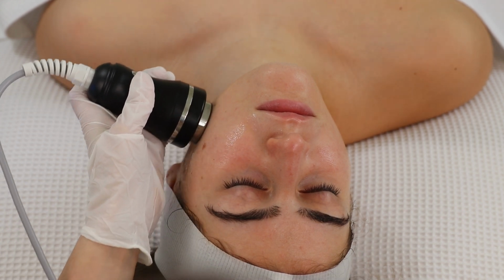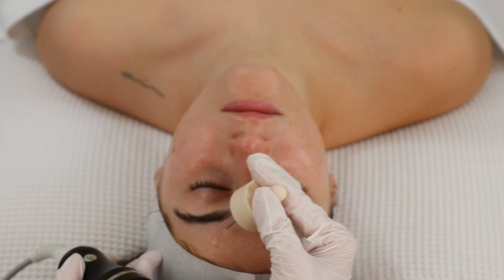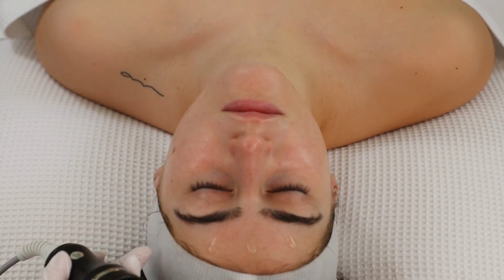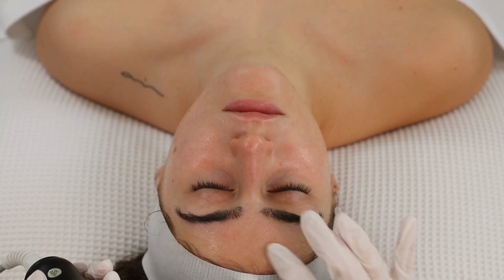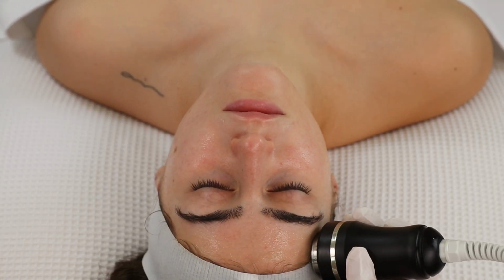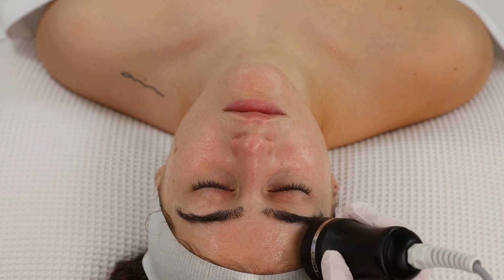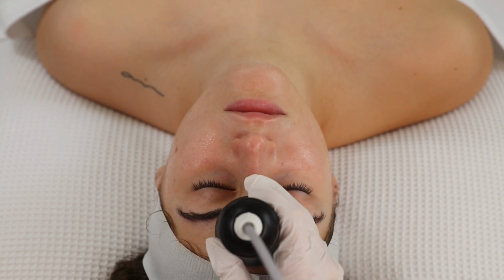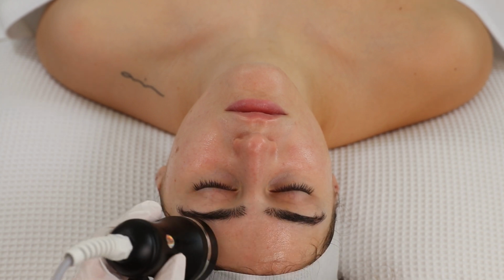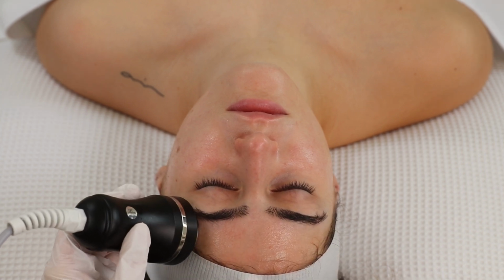Once the left side of the face is done, you can repeat the exact same process on the forehead, apply the serum, and then carry out the no-needle mesotherapy. When you've covered all areas, you're ready to move on to the next step.